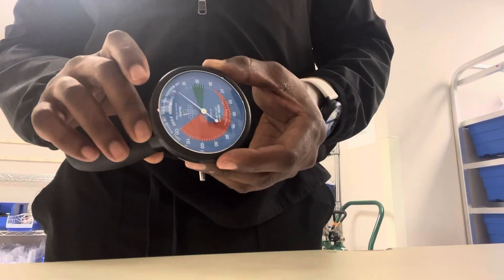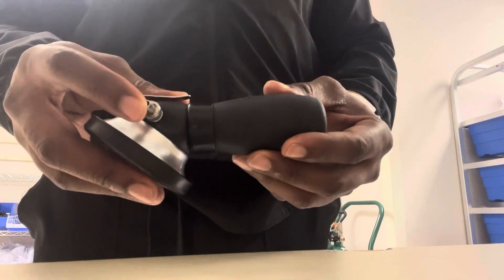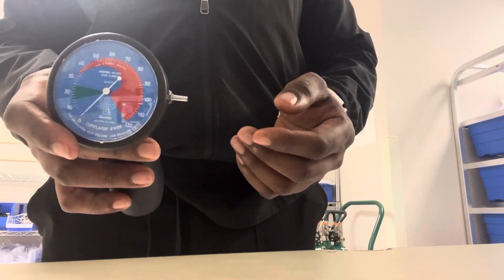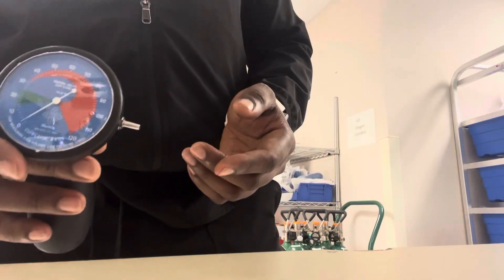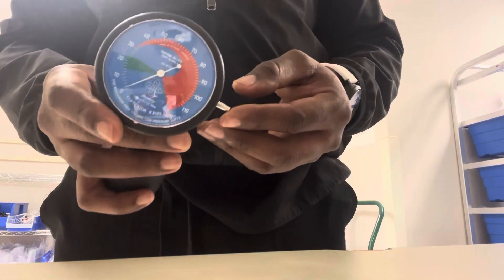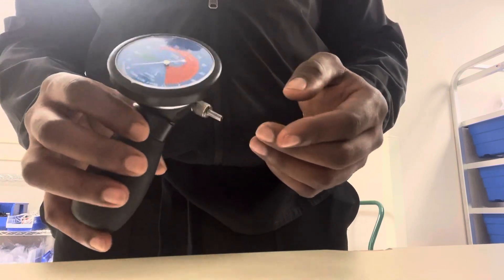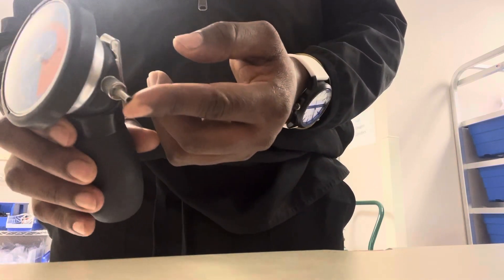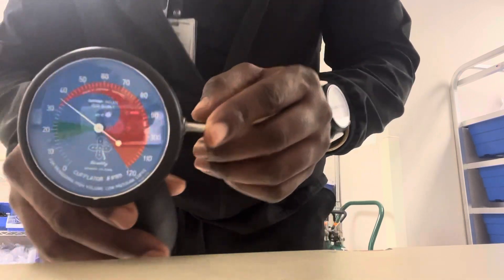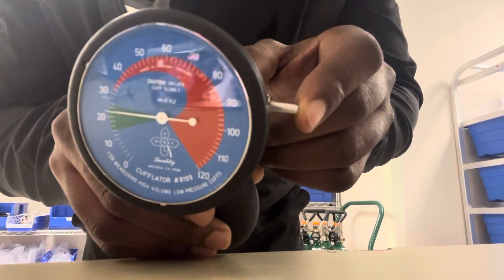This is a pressure cuff manometer. We attach this wick here to the pressure cuff that's in the patient's trachea. It gives us a reading to see how much the cuff is inflated. To test the cuff pressure, you attach this to the cuff and squeeze this dial, and this small reading here will let you know how much pressure is in the cuff.